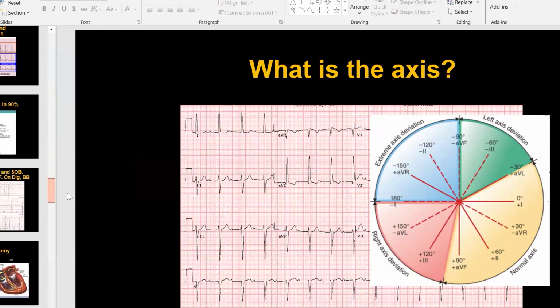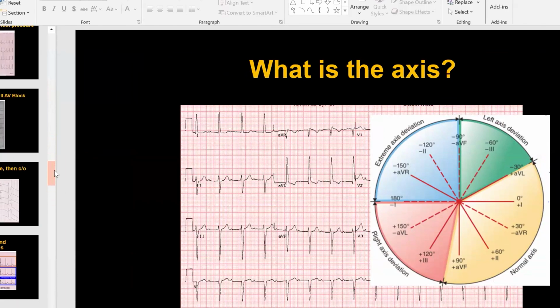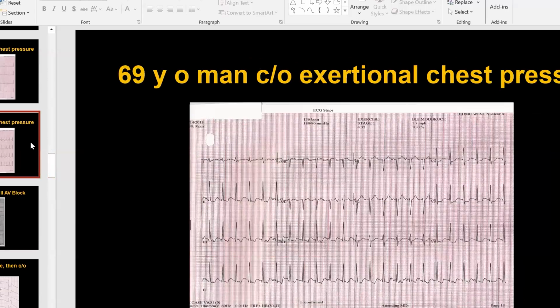And then the next slide you showed the rate was controlled and the ST depressions were gone. Maybe you're thinking of this? No, but that's sinus rhythm. No, it was an AFib. You talked about AFib. Yeah, well, okay. I can't find it, but I'll answer. Let me answer your question.